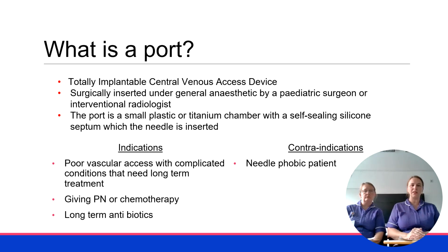Contraindications. So there aren't that many contraindications. We wouldn't advocate putting a Portacath in a child that's needle phobic for obvious reasons, and you might consider not accessing the port if we think the child might be septic and you don't want to give them a septic shower.